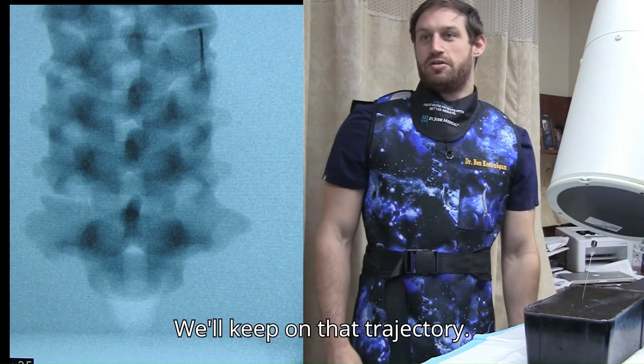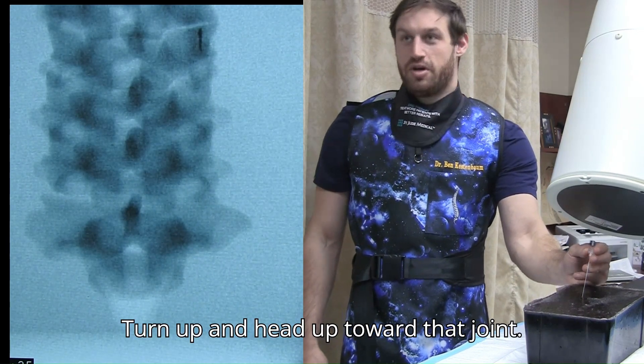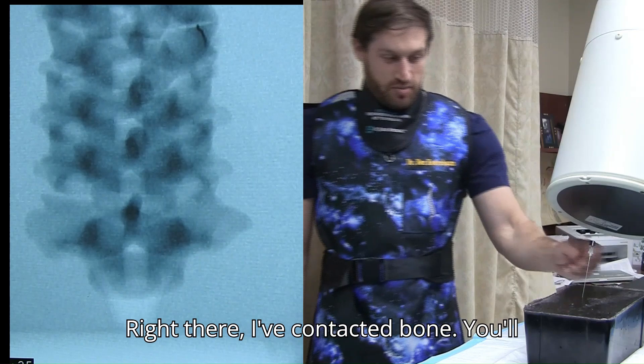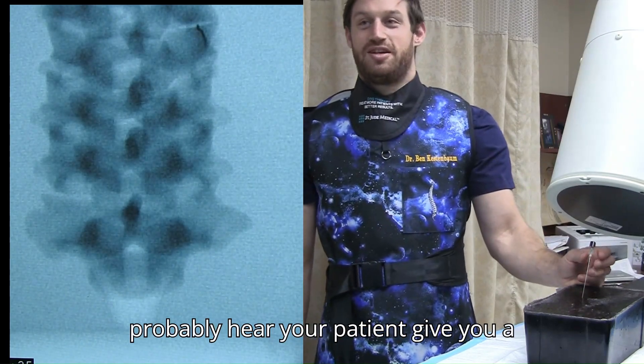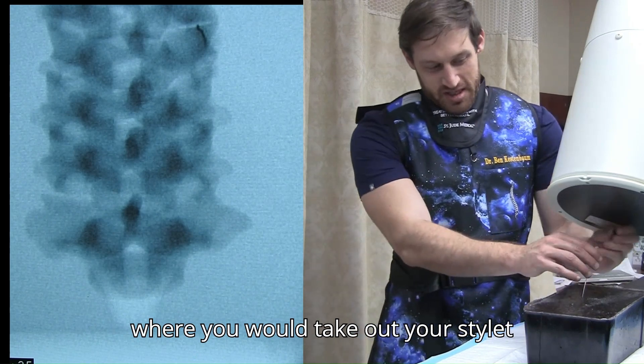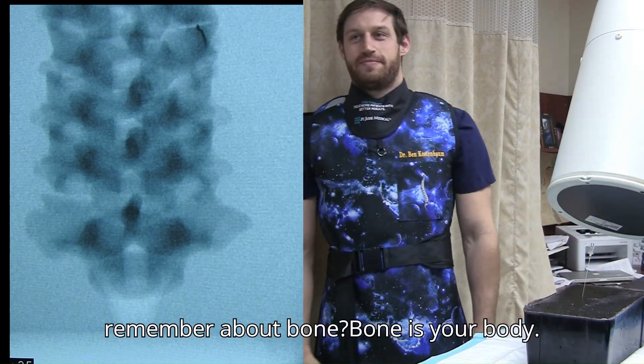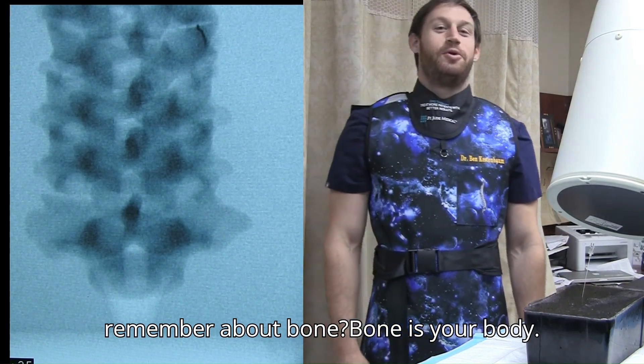We'll keep on that trajectory, turn it up and head up toward that joint. Right there I've contacted bone — you'll probably hear your patient give you a little verbal feedback. And there is where you would take out your stylet and inject. And what do we remember about bone? Bone is your buddy.